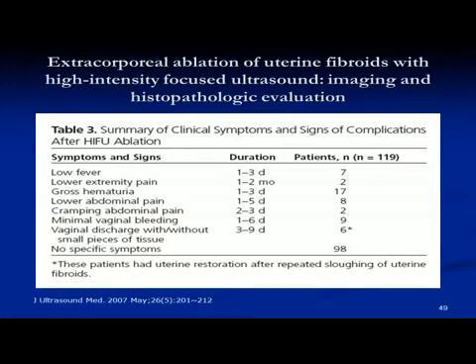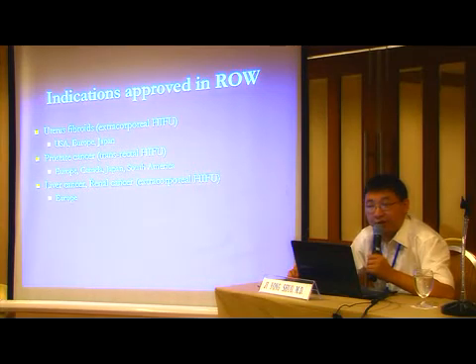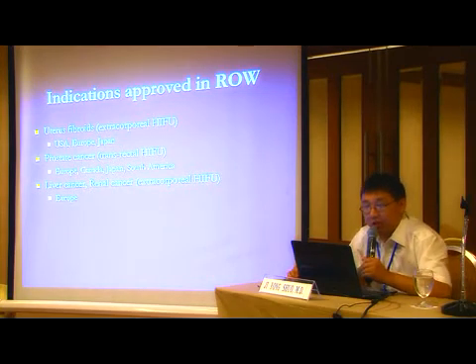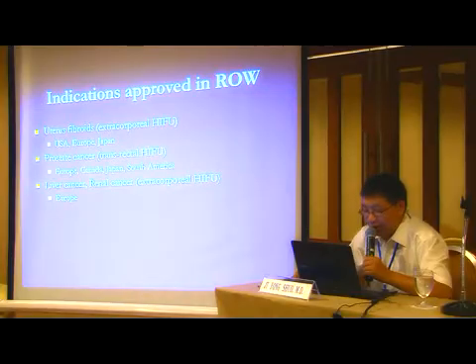A large number of experiments are being held in the world. For the treatment of tumors with HIFU, it is prescribed by the FDA like that. We will find many spaces for change in the practice. In this treatment for tumors, HIFU may not be the most effective, but it is definitely the safest. With the safety and effectiveness, the comprehensive total score may be the highest.